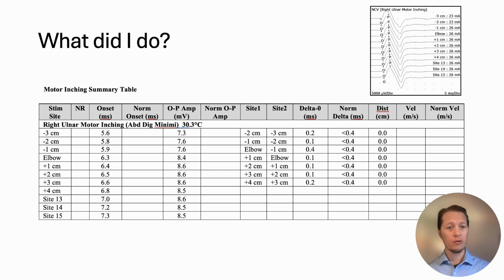Well, we went through and did the 1 centimeter, and amplitudes do not drop when you go proximally. The latencies were pretty much 0.1, a couple 0.2, and then one segment very clearly went right up to 0.4, which is considered right up at the upper limits of normal in terms of latency. Aha, maybe we're onto something now.